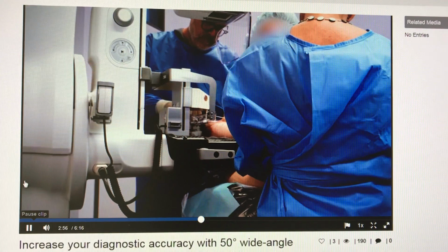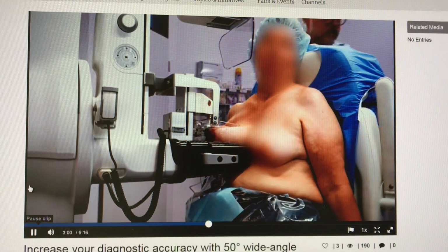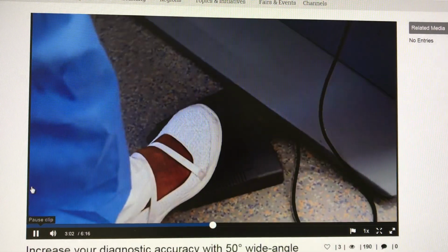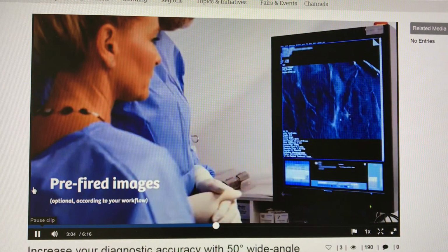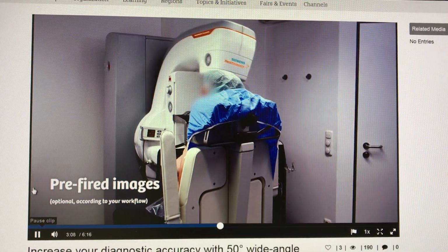We then position the needle, or in this case the mammatome, until it reaches the target. Then we perform our pre-fire acquisitions, followed by our post-fire acquisitions.